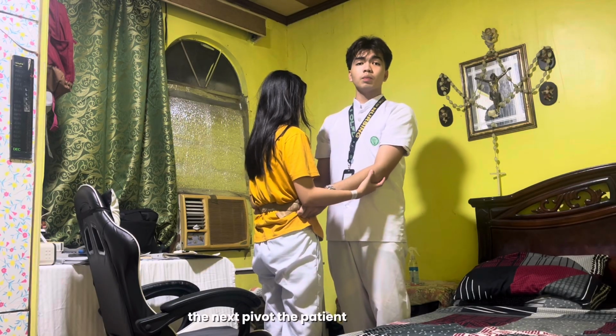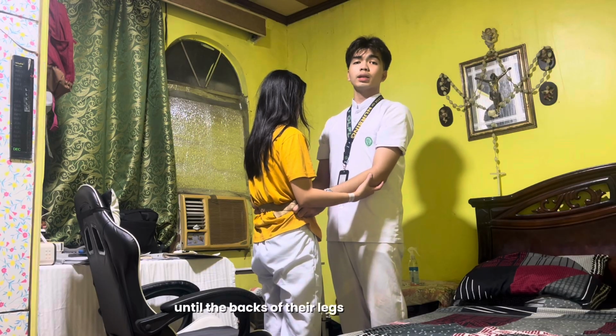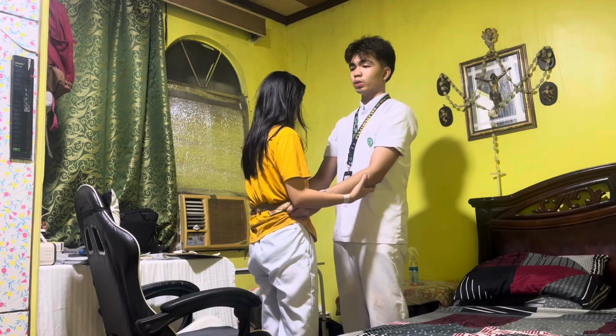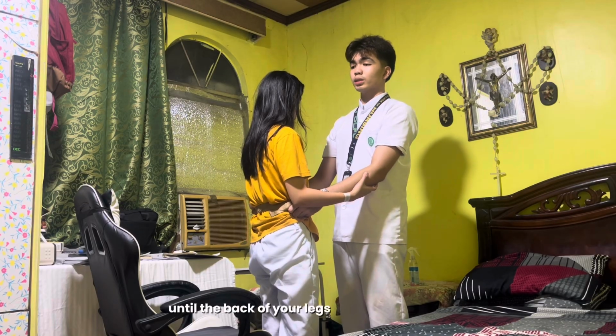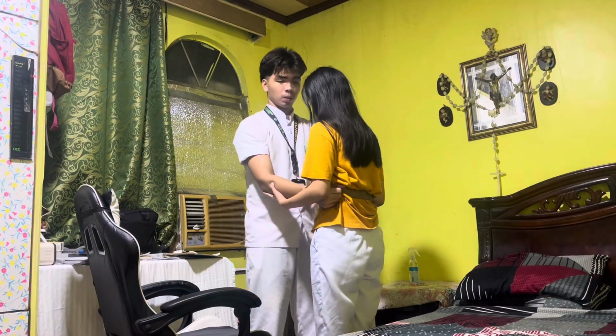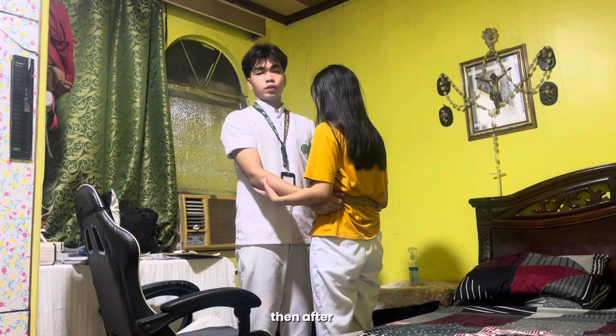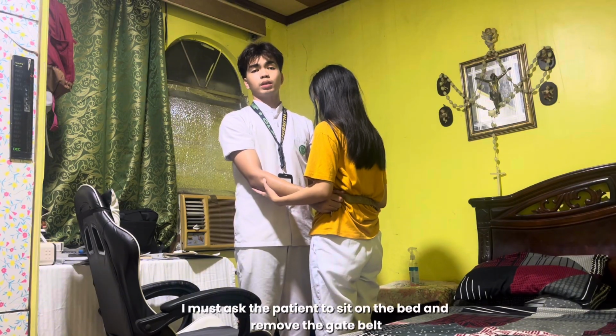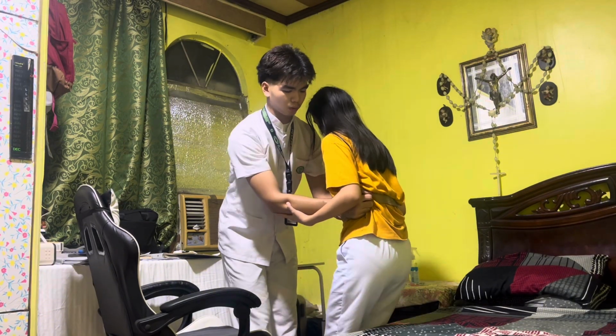Then next, pivot the patient toward the bed until the backs of their legs touch the edge of the bed. So now, let's turn slowly toward the bed po, and I will assist you until the back of your legs are touching the bed. Okay? Then after that, assist the patient to sit on the bed and remove the gait belt. So, sit na po.